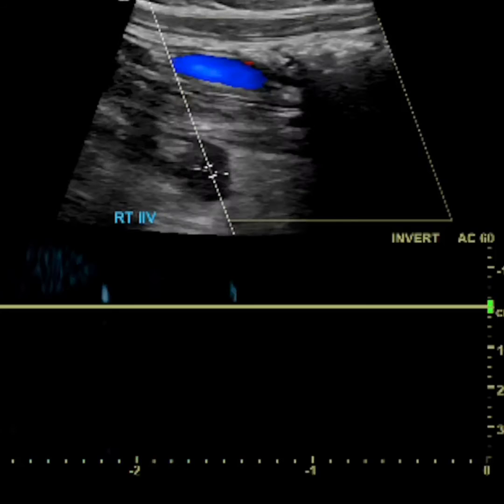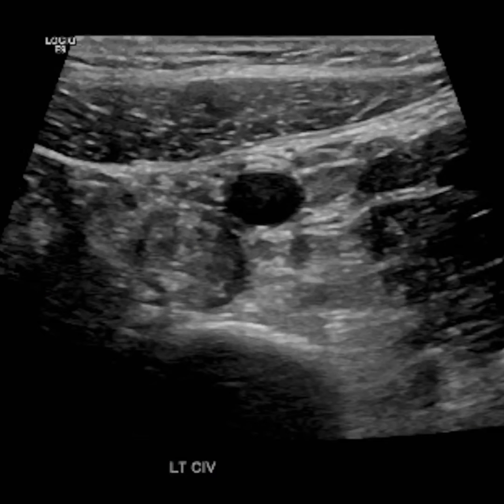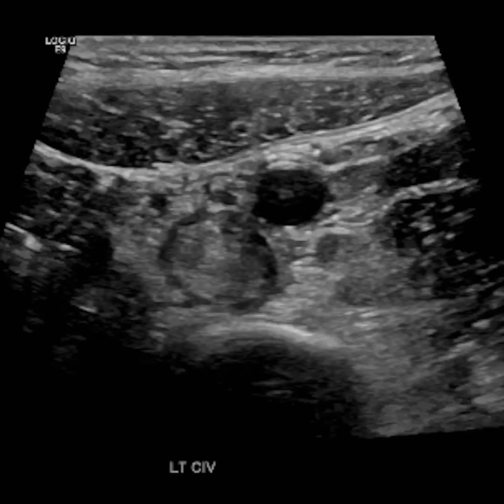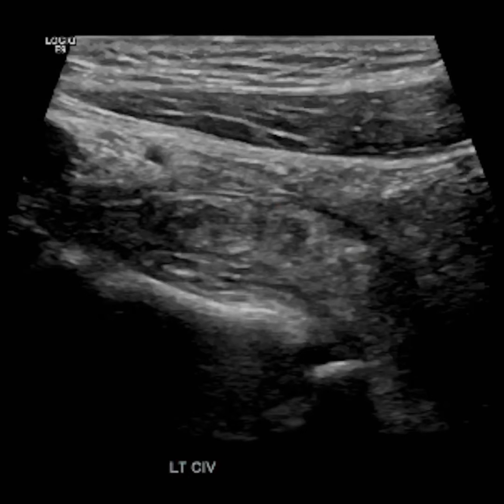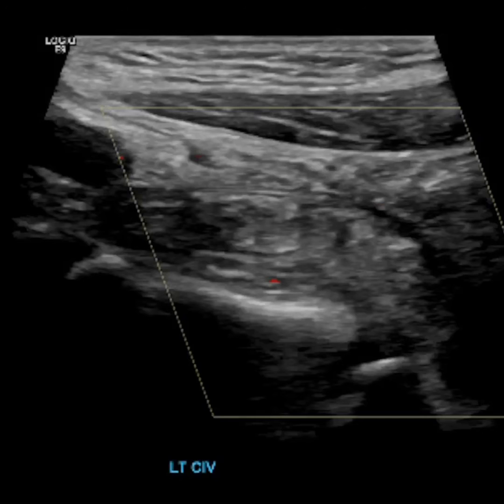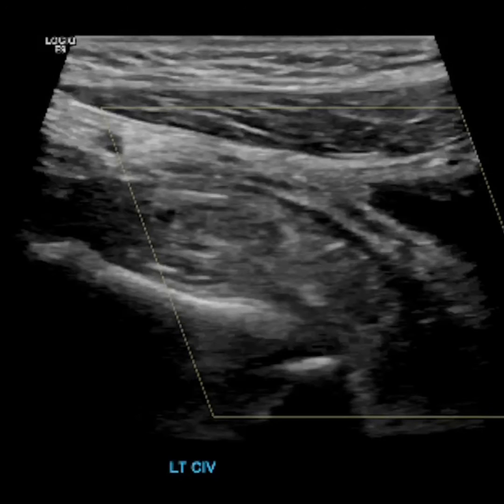The DVT extended down into the common femoral vein, superficial femoral vein, and great saphenous vein.